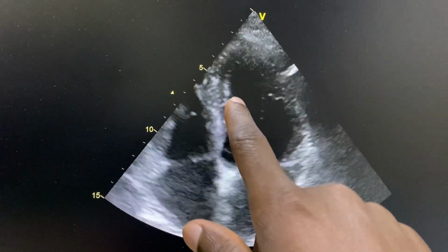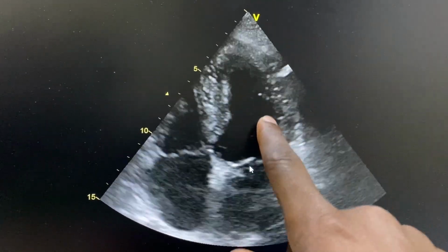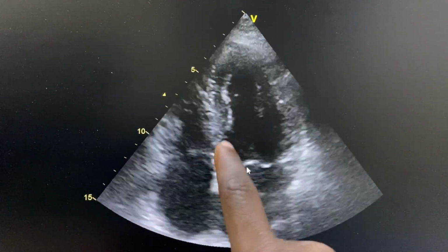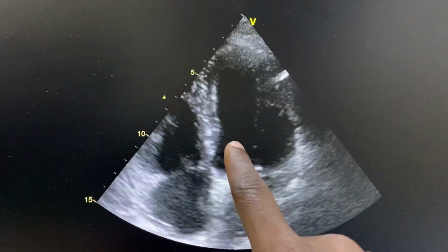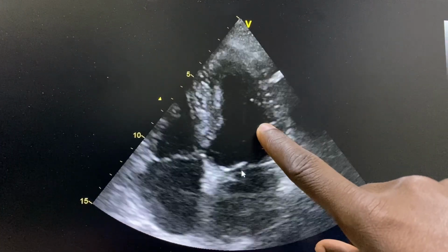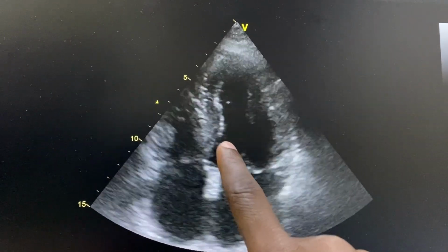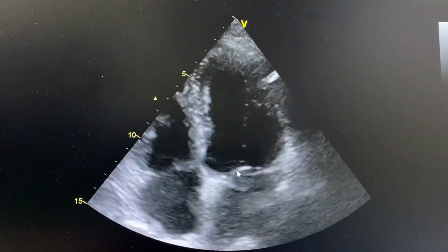The endocardial lining is there. This is papillary muscle here. We're not seeing it there because remember inferior septum. We're not seeing inferior septum here. We are supposed to see some papillary muscle. We can see it here. These are chordae tendineae, but the anterolateral papillary muscle is here. Anterolateral papillary muscle, its chordae tendineae going to the mitral leaflets. They are here. And then the inferior septum papillary muscle is almost there, but it's here, it's not so clear.